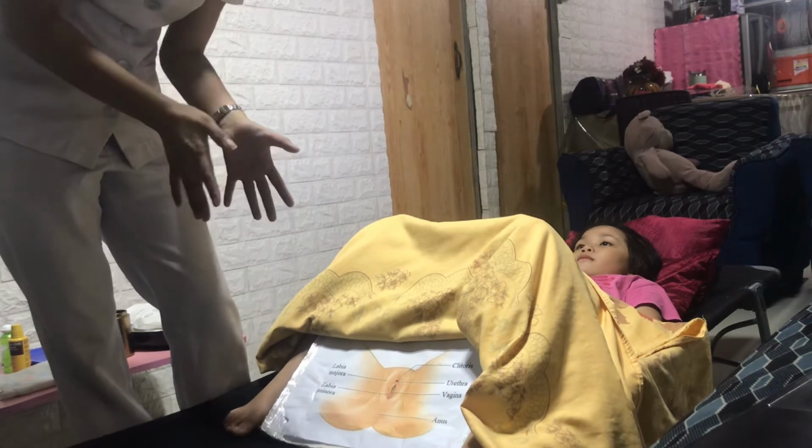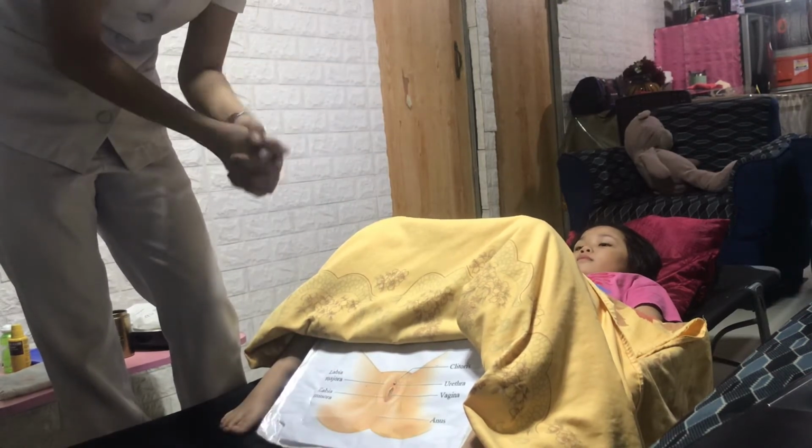Next, I will be preparing the materials, observing the sterile technique. I will be using a working glove in order to prepare the materials that I will be using in this assessment.